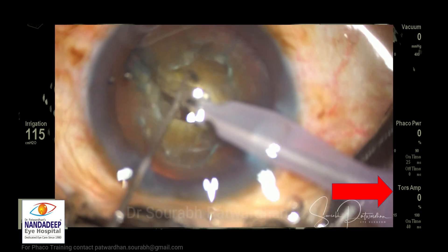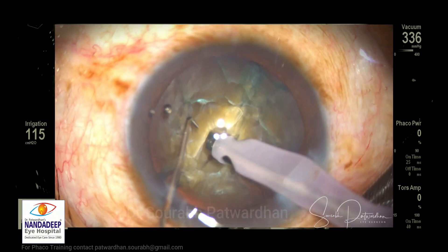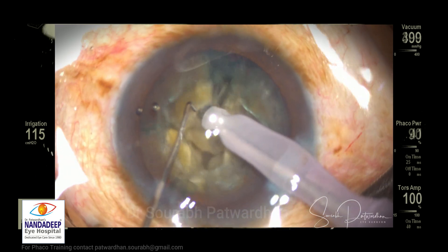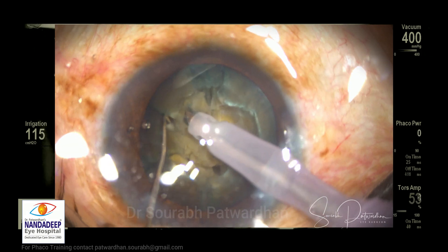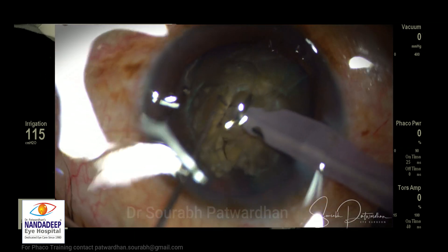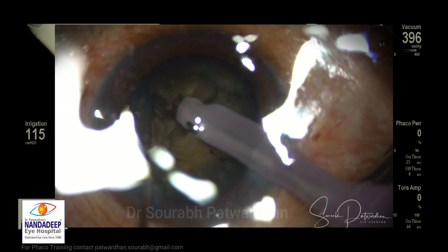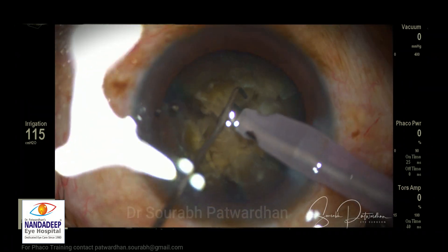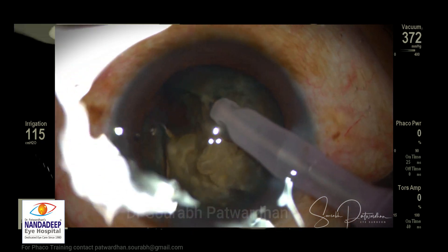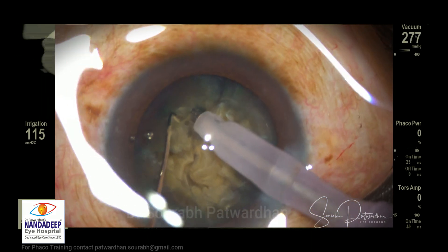As you can see, I divided the nucleus in two halves. The longitudinal power really helps in burying into the nucleus and then achieving a good hold. I am using a one millimeter Sinski which is blunt — we don't actually need sharp instruments to break the nucleus. I just need a good hold, which is provided by burying the tip using both longitudinal and torsional modes, and I am using 400 vacuum to hold the nucleus. The exposed tip is around 0.75 millimeter; we can increase to 1 millimeter if the hold is not sufficient. The chops are being delivered very easily — I am very slow and methodical in my approach.